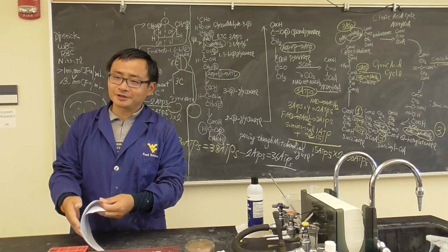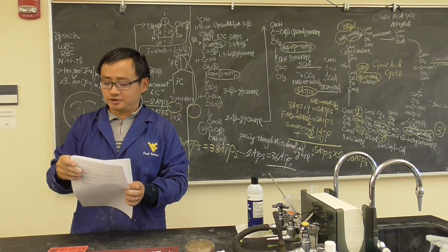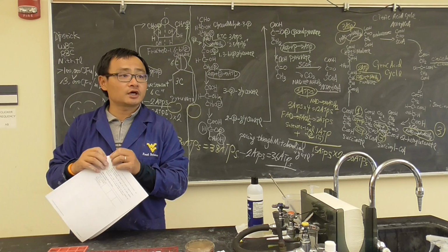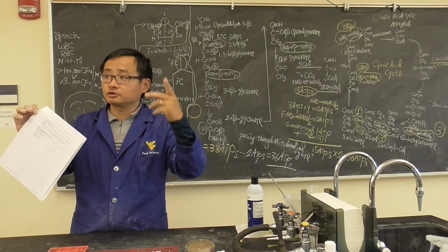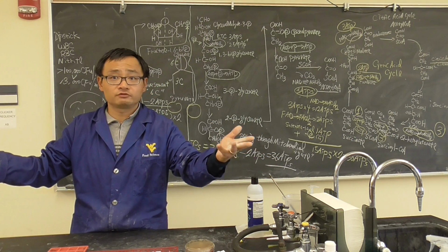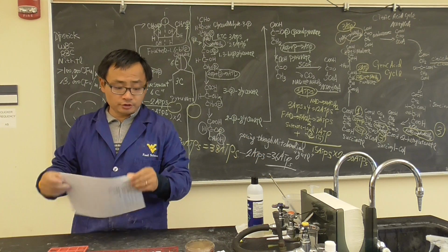This will be a lab testing, also working with 2 of you or 3 of you. If you don't have a tonsil, you can do a combination, maybe 3 of you. Some of your tonsils are taken out, but what's the reason your tonsils are taken out? Because it's a reservoir for bacteria. Is that correct? So what are we going to do?